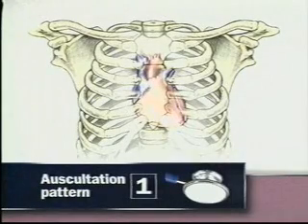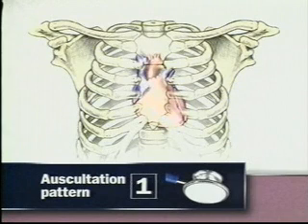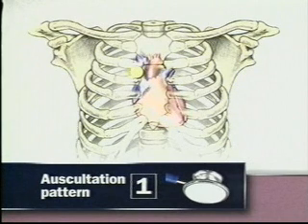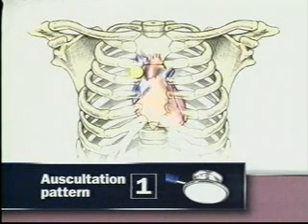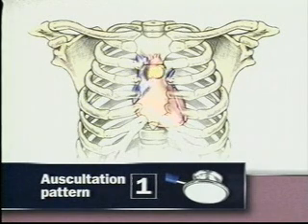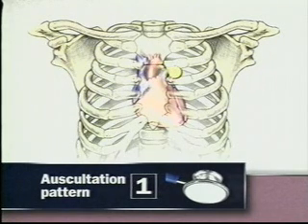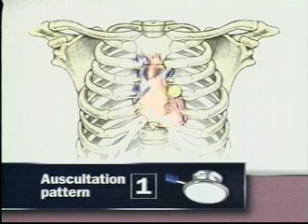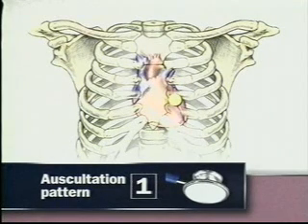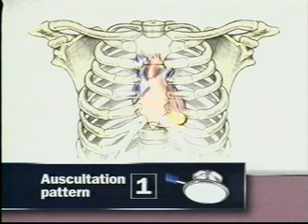For auscultation of the heart, you may choose between two sequences. In the first, start with the diaphragm of the stethoscope and progress from the right second interspace to the left second interspace and down the left sternal border to the apex.